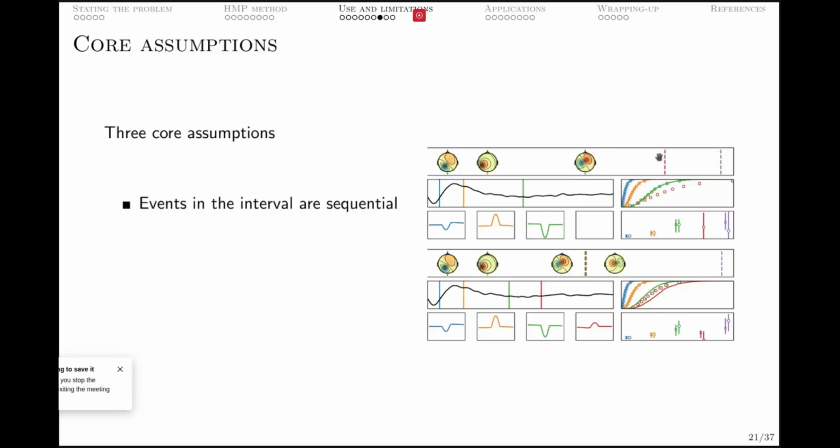So it's really just independently moving around in the stimulus-response interval. In this case, we don't observe it in the HMP solution, right? Because this event is not giving us any information on where to look. It's basically just randomly before, after, or very much after, and we therefore miss this event.